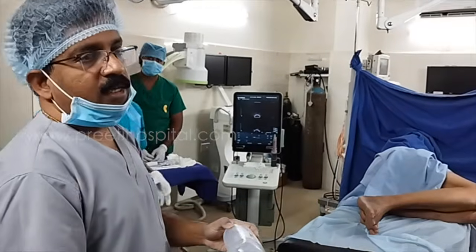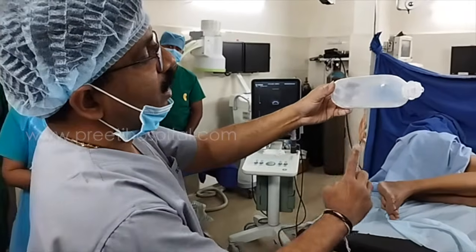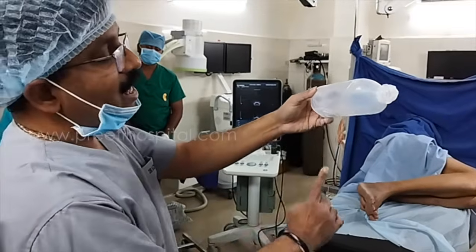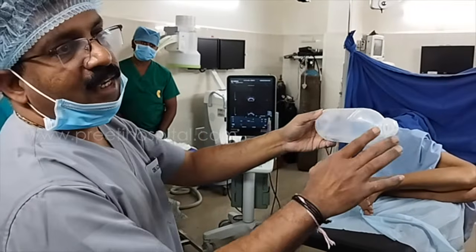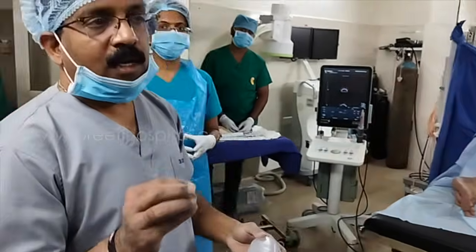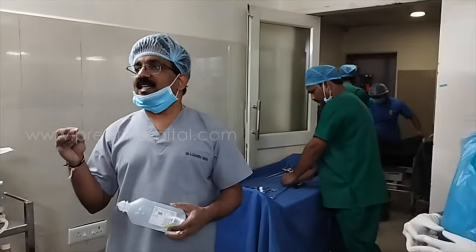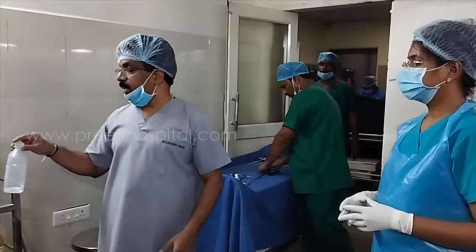This is the model. So if you take all axial, you take like this, so the thickness of the periphery will be less. So only axial in all regions is not correct. That's why monoplanar biopsy is not ideal unless it is an apical tumor. Only in the apical region we can take it.